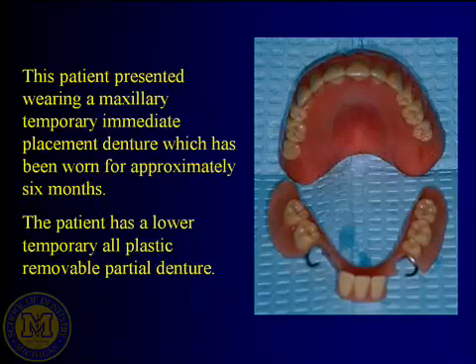What do you suppose is something I look at that overrides even, and I'm not discounting that, that's important. What's something else is we're monitoring these patients through the time that they've worn these transitional appliances. And in fact, it's one of the reasons in some cases that we make transitional partials. What are other things I'm looking at with the patient?